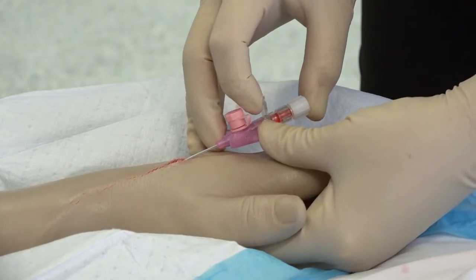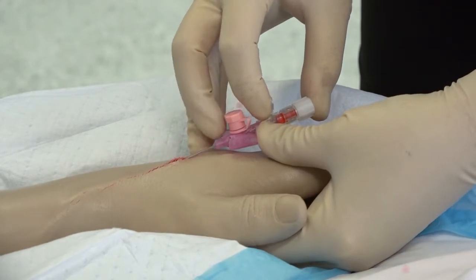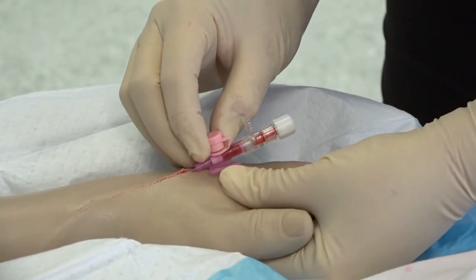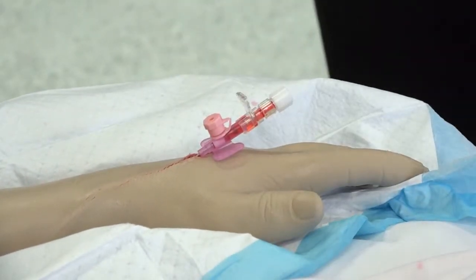Pull back gently on the stylet a few millimetres. You may also see a second flashback along the cannula. The sharp point of the stylet is now located within the plastic cannula and protected from further puncturing the wall of the vein. Advance the entire cannula along the vein until the hub is reached, then release the tourniquet.